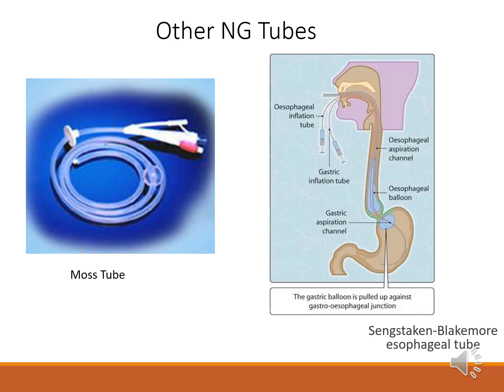For safety, an SB tube patient should have a nurse present if they are in the imaging department for a long time. This is crucial to avoid risks of asphyxiation or aspiration of stomach contents into the lungs. Patients with an SB tube are typically cared for within the ICU and portable imaging is performed.